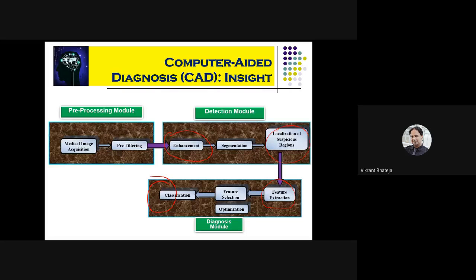There will definitely be non-satisfactory performance of the feature extraction. Because if this module's response is not good, then even if your feature extraction algorithm is very good, if the right region is not localized or not segmented properly, you are not going to get the actual features. So once the actual features are not given as input to the classifier, the results may saturate beyond a particular point.